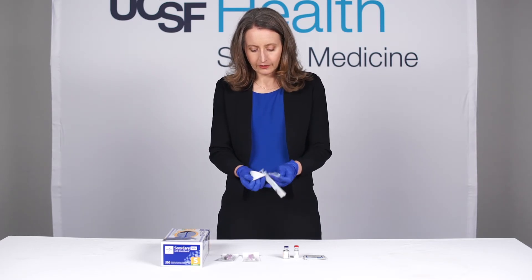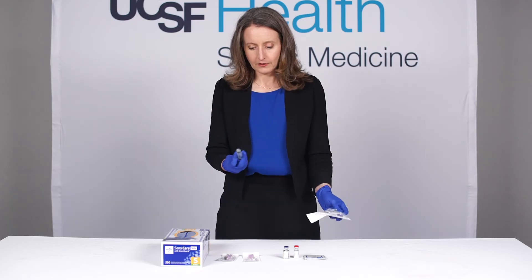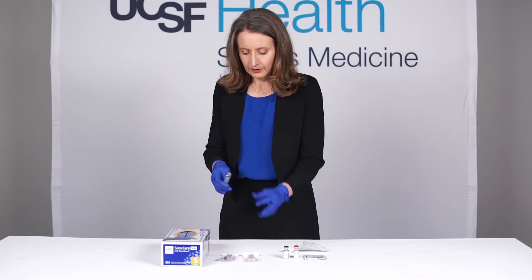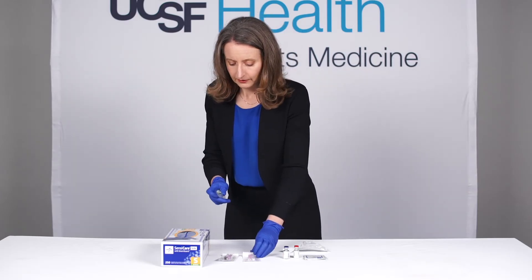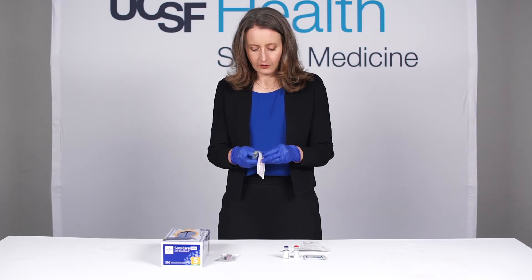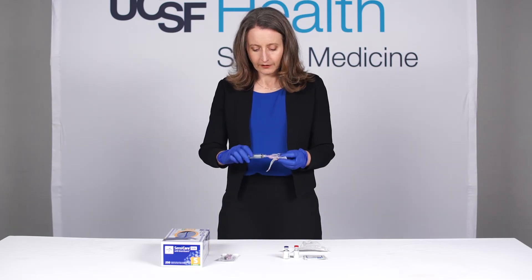The field is not sterile here, so what I do is open the supplies in a sterile fashion. My gloves are also not sterile so I'm keeping everything clean. I'm going to take a large bore needle — this is an 18 gauge needle — and put that on the end of the syringe.